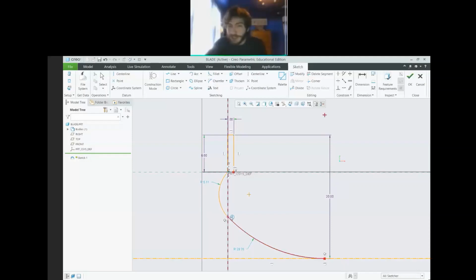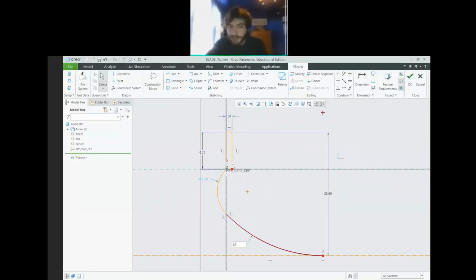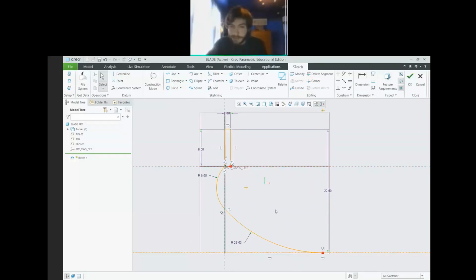We can always come back and change it. That's what's great about parametric modeling. When we're done with this whole thing, we could decide that actually we hate everything we did, and that's okay. We can come back and drag this up, and maybe we think that'll be better. I think this looks somewhat reasonable to me. If you want, you could plug in numbers. I could make this 23, I could make that 5, and I can fix the whole thing a little bit more. So I'll give you guys a little bit to play.